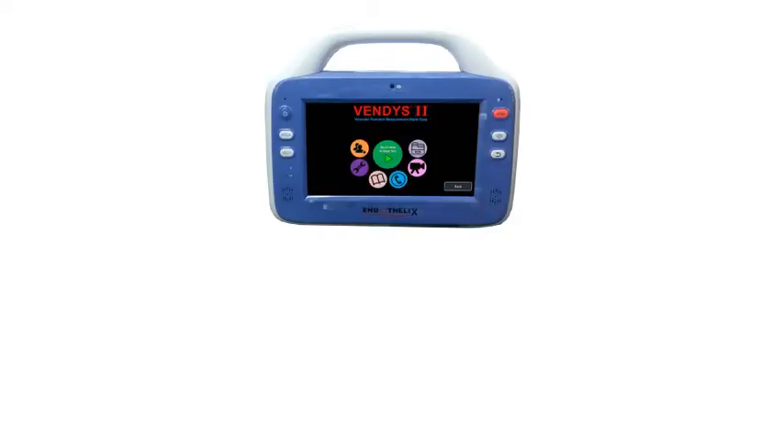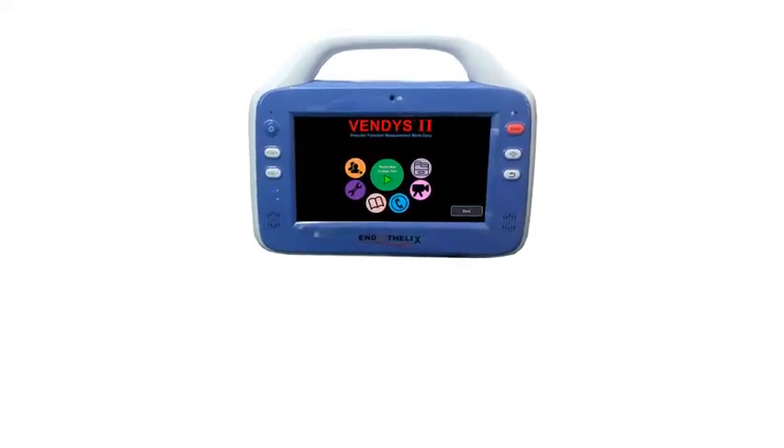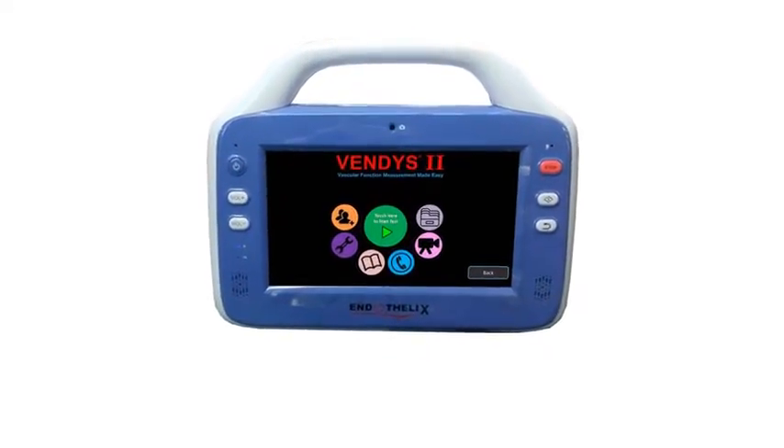In the next few minutes, you will learn all about Vendis 2 as our staff walks you through every step. But before then, let's introduce you to the components of Vendis 2.